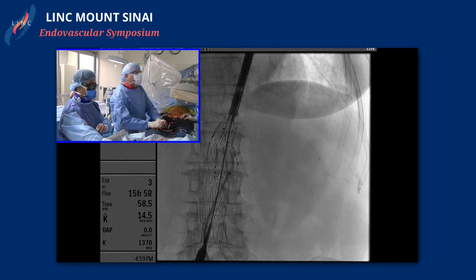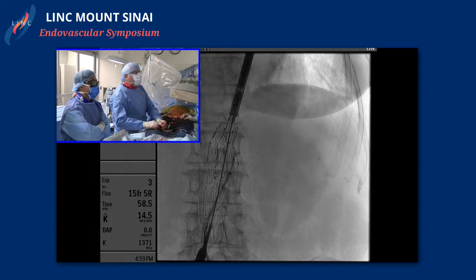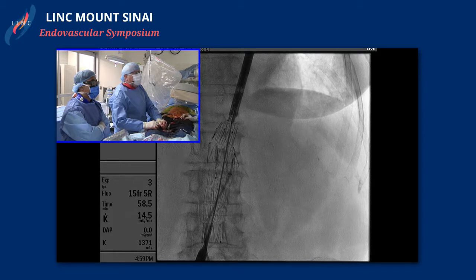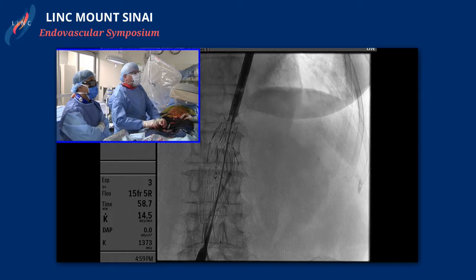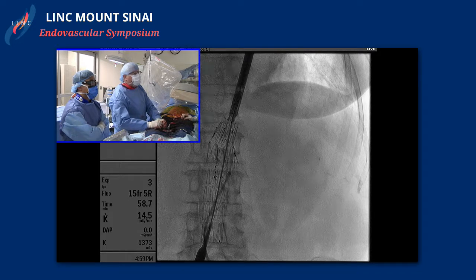Dr. McKenzie, how are you doing? We've gotten into the graft now. We have a calcific origin of the left renal, so we've gotten into it, we just aren't able to track. We changed our sheaths out, so we now have a little bit more substantial sheath to get in there. And we're just working on the left.